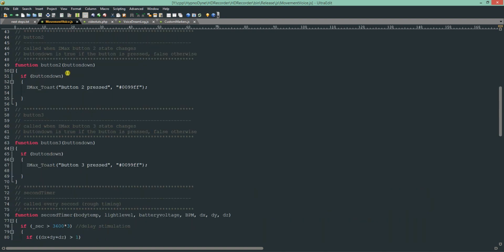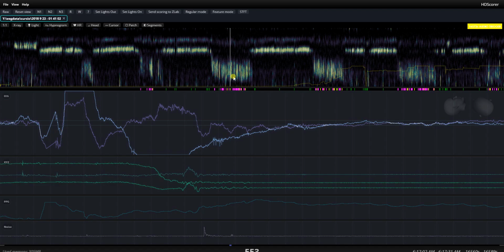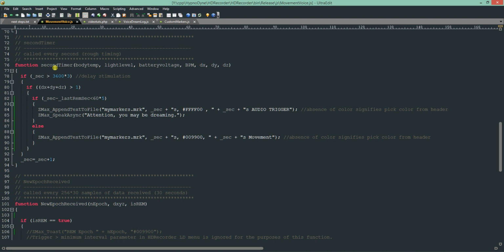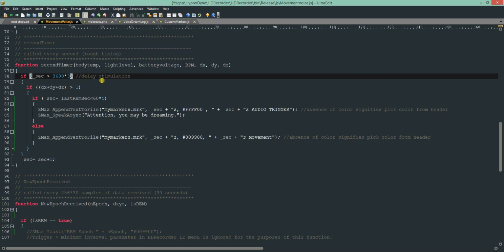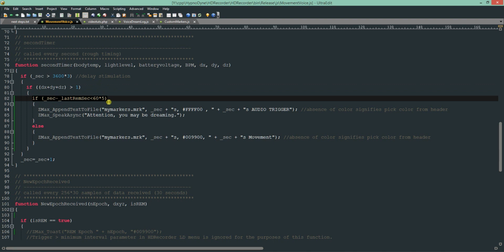I could perhaps change the function of a button and give it another countdown so that if you're getting a stimulation and you actually don't want to be bothered for half an hour, you could easily use the button. But that aside, the way this is done is, first of all, I delay any stimulation for 3 hours from the beginning of the recording. That's why you don't see anything here. In the beginning, you're trying to fall asleep, so you don't want to be bothered. So wait 3 hours.